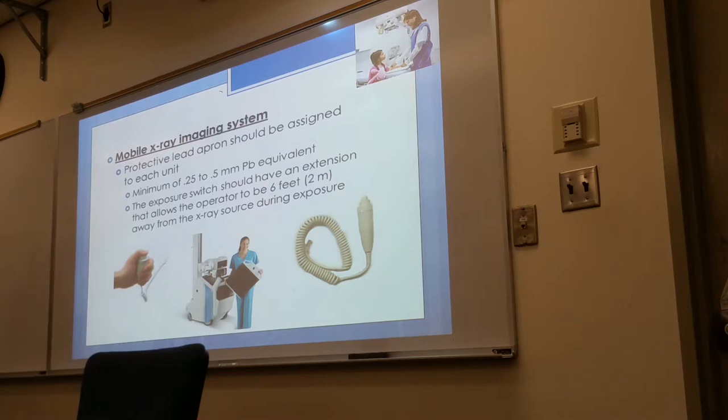As long as you are far away from the source and the patient. A minimum of 0.25 to 0.5 millimeters of lead equivalent is necessary for radiation protection. The exposure switch itself should be of an extension and operable at a distance of 6 feet away from the X-ray source and the patient during exposure.